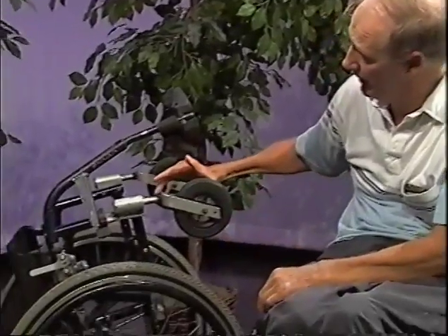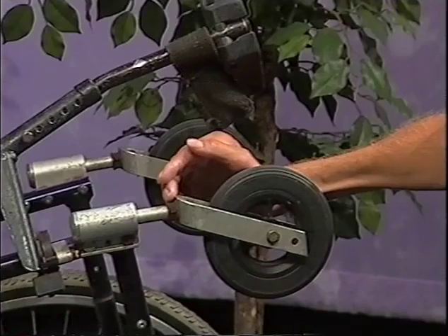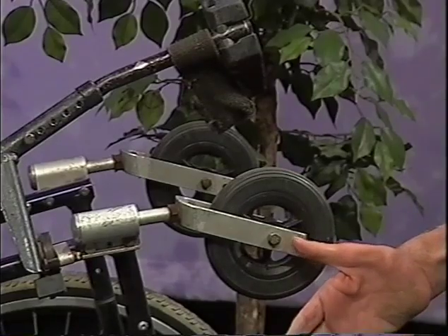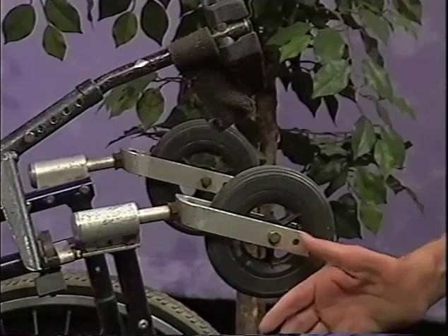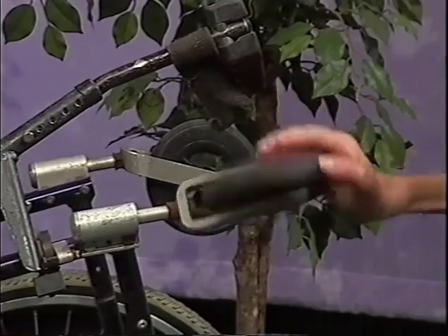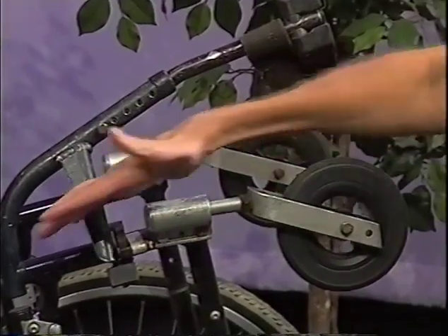On this front end, this is my everyday chair. You have a different type of fork. We have a 1.5-inch extended bolt for the fork stem. And what we've done here is take the wheel out of this hole. The axle is now mounted up in this other taller hole. What this does is it shortens the sweep of the wheel, but it allows it to clear the foot plates while the fork stem is still in front of the down tube.